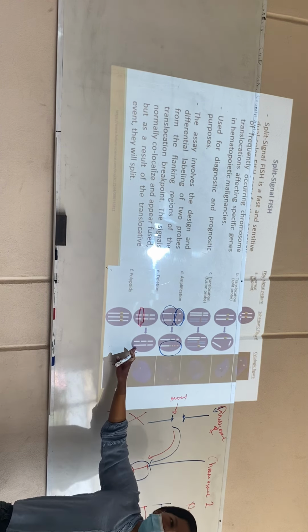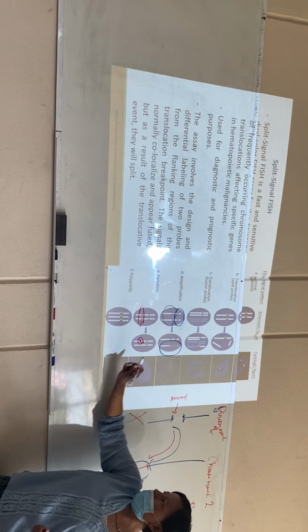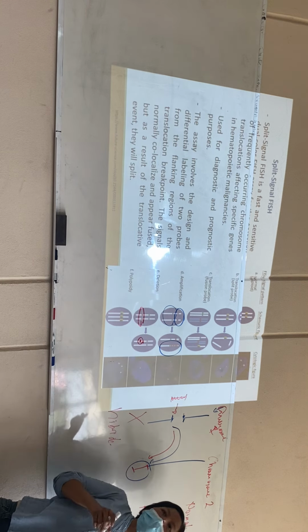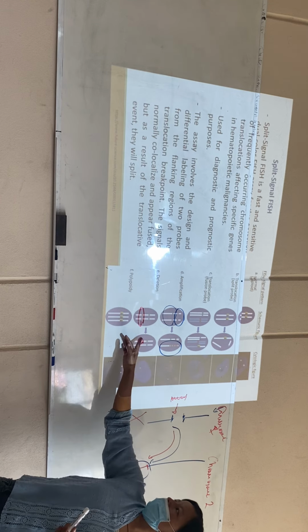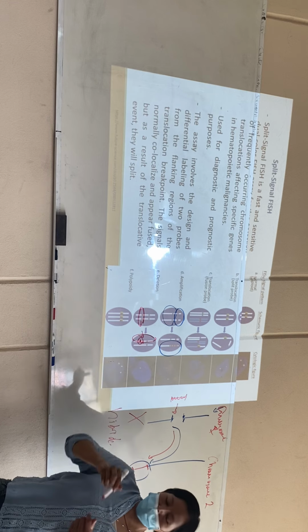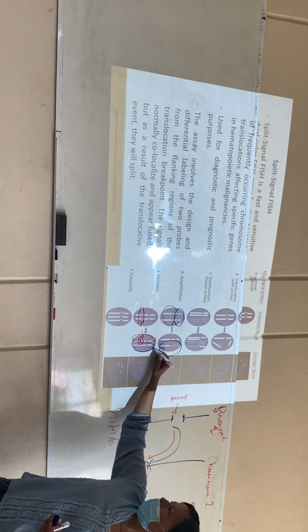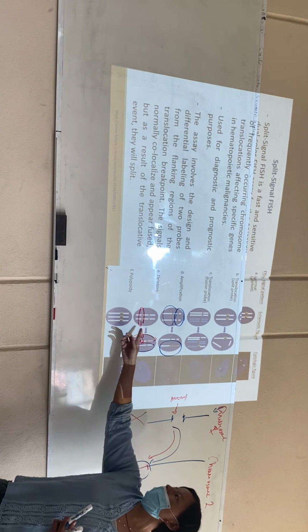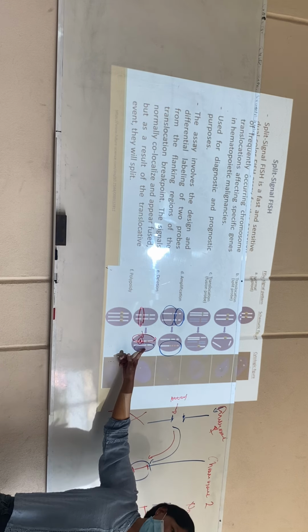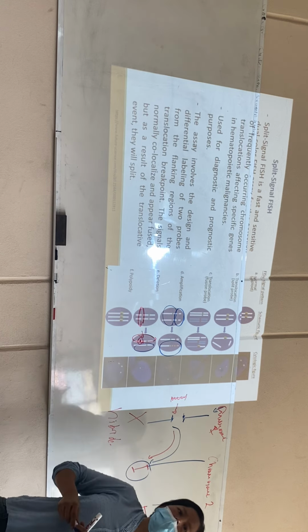What happened here is that only one of the chromosomes has the gene and the other has already lost that specific gene. So the probe directed to this gene, the red one, is going to hybridize here, but it's not going to hybridize here. And then I'm going to notice a difference in the intensity if I compare a normal chromosome against a deleted chromosome. Okay?